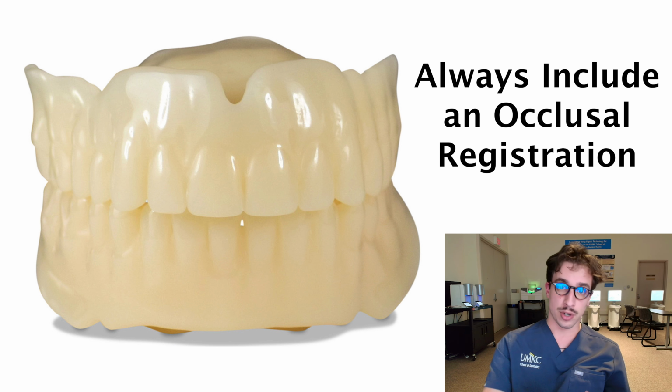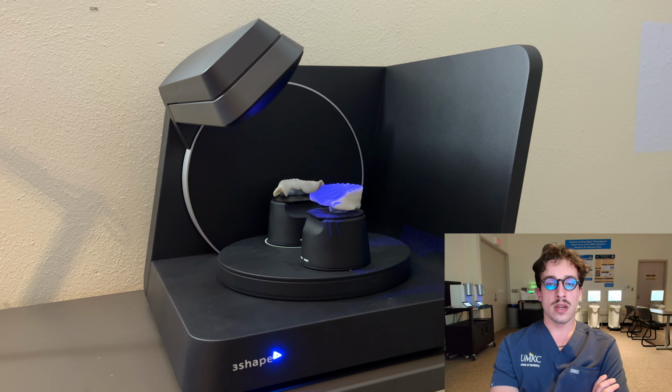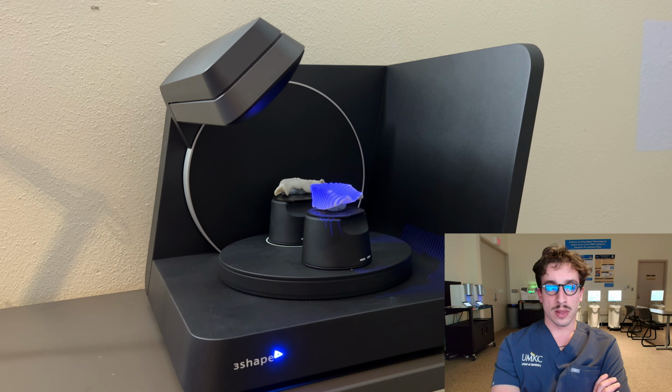So really the big thing for this is you've got to be able to communicate the changes that you want to make to the lab. And what I always tell people with these digital dentures is your success with these digital dentures is going to depend on how well you're able to communicate with the lab. And I think that's very applicable for private practice as well. You can't just send them a scan of a wax rim and expect to get back a perfect final denture. You're going to need to explain what changes you make. Otherwise, this will be a frustrating process, I won't lie. But if you're able to write a good lab script and clearly communicate the changes, then the lab is really good about making these changes.